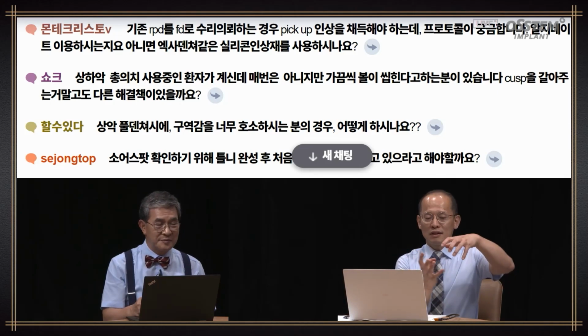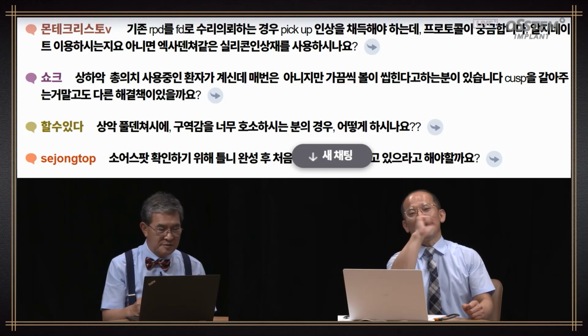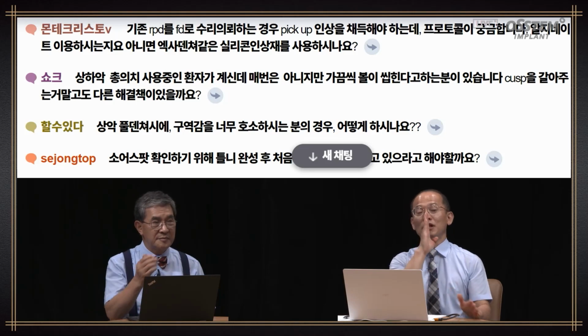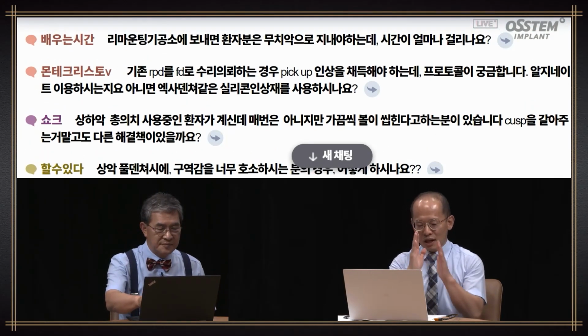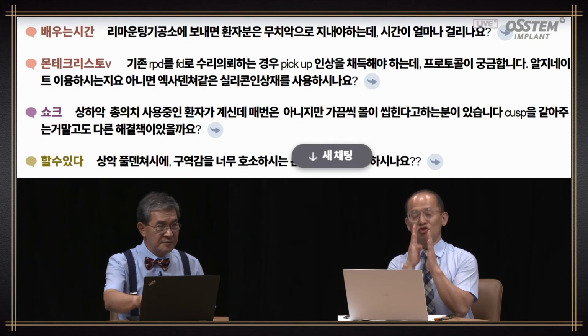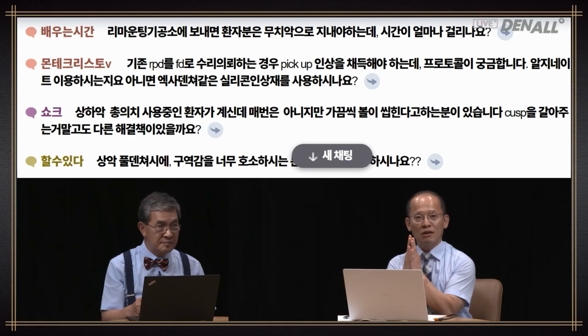But of course, the issue might be that you take the bite and get it to the lab, but it cannot be adjusted. So for the midline shift, sometimes that happens often. The central incisor width is 6 to 7 millimeters, so I only have within half.